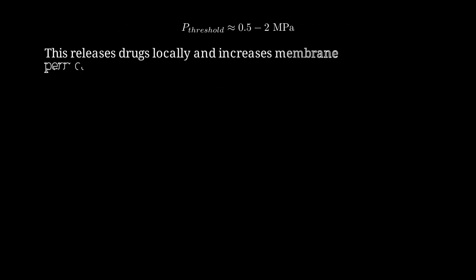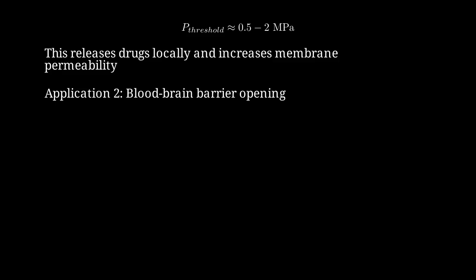Bubble destruction releases the drug payload locally and creates temporary pores in cell membranes, enhancing drug uptake. Second, focused ultrasound with microbubbles can temporarily open the blood-brain barrier for drug delivery. Blood-brain barrier opening requires careful parameter control: pressure of 0.4 to 0.6 megapascals at frequencies 0.5 to 1.5 megahertz.